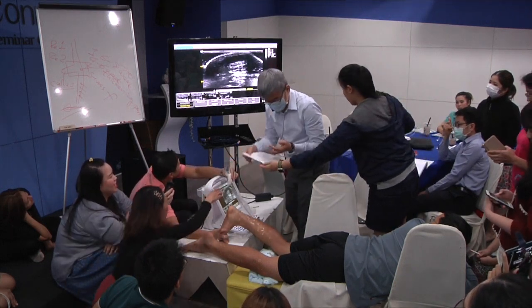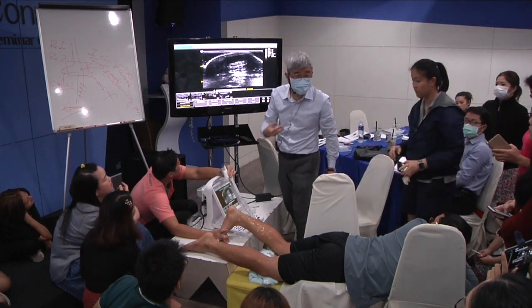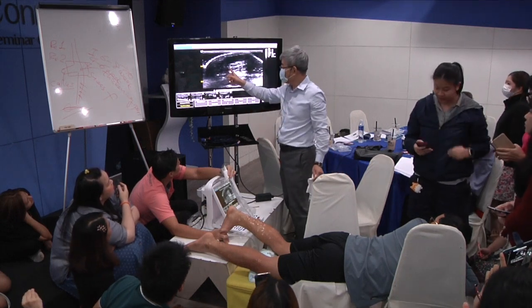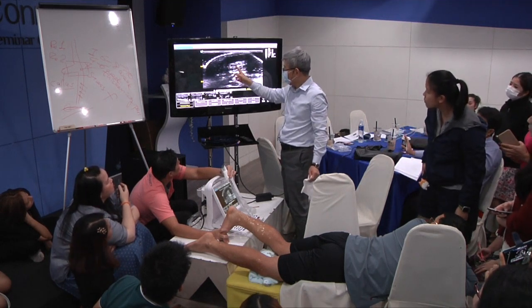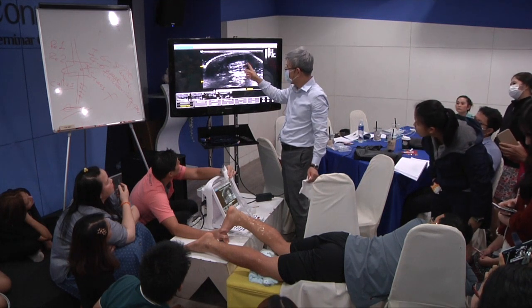Thank you very much. Okay, my question is, when you are stretching the Achilles tendon and you want to measure the change in diameter, the width changes, right? Option one, you calculate from here to here.